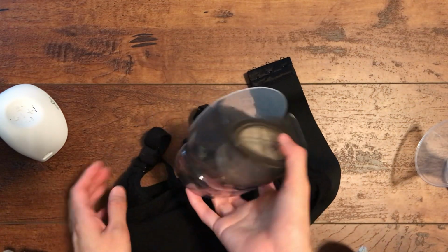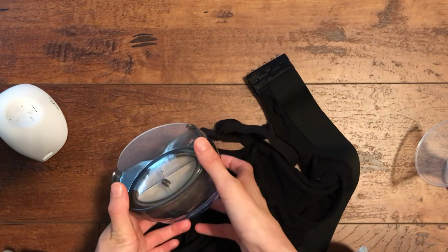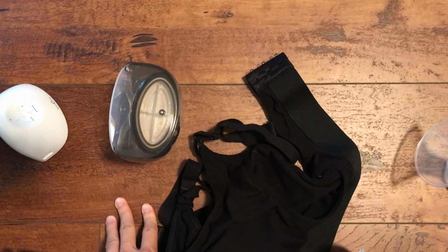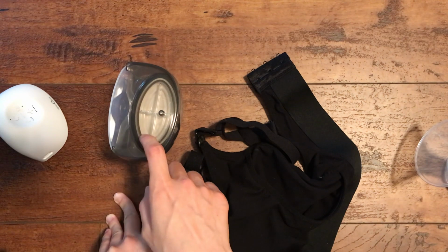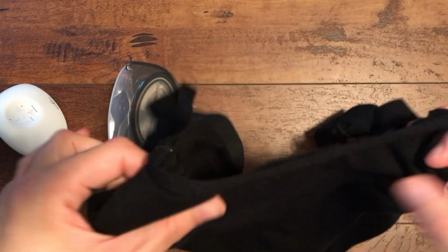But that's not really the fault of this pump. It's really with any wearable bra that you buy. That's just one of the things to consider. So make sure the suction isn't lost midway, and to do that, try to minimize the movement of this unit in your bra, is what I found to be important.